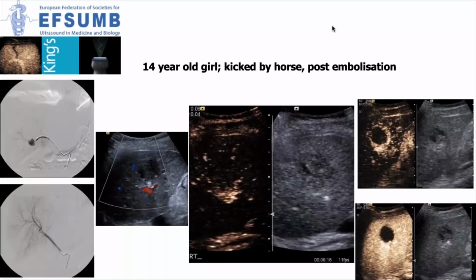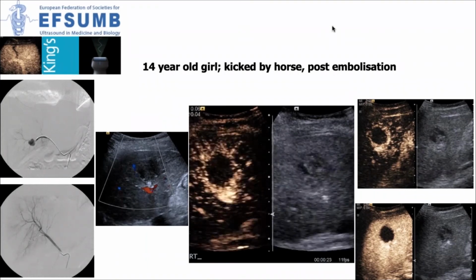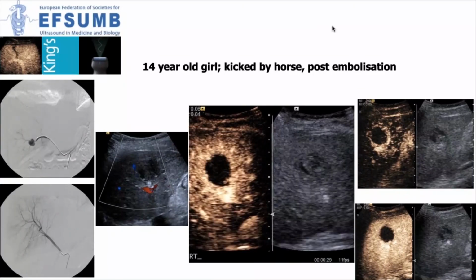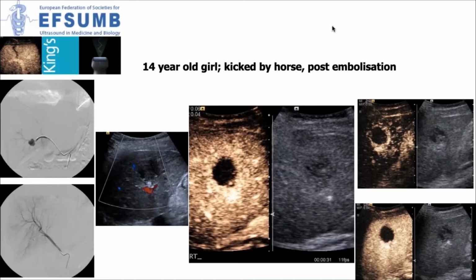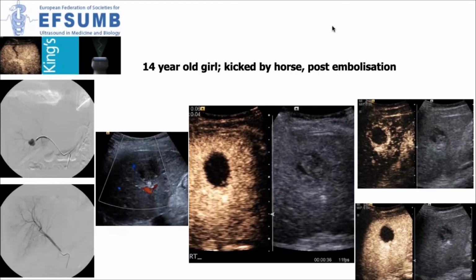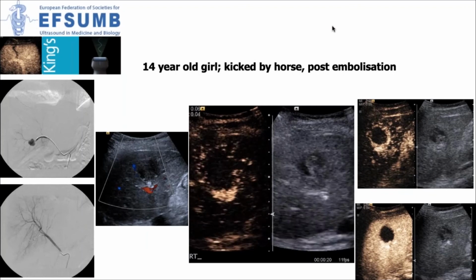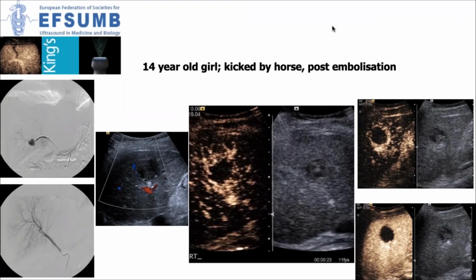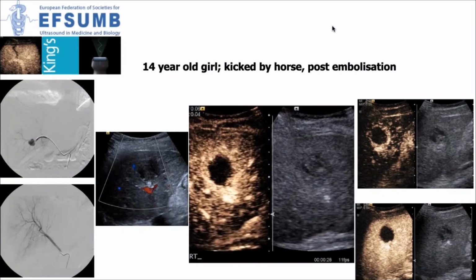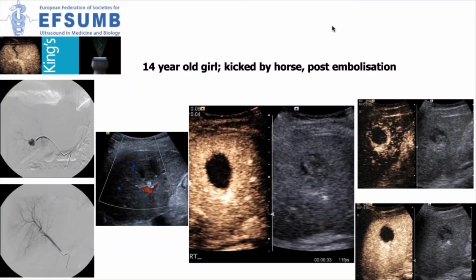And indeed, in our population, what we also do is we follow up post-embolization of these pseudoaneurysms to ensure resolution. Now, this may be difficult to see, particularly if you fill a sac with coils and you're not sure the echogenic material there is from coils, and you may cause artifacts on Doppler. On CT, you may simply see a lot of artifacts and not be able to assess the surrounding area. But contrast-enhanced ultrasound means that you can definitively tell that you have treated this area. And indeed, you can do it at the same time as intervention, and you can also tell whether or not you need further embolics at that moment.